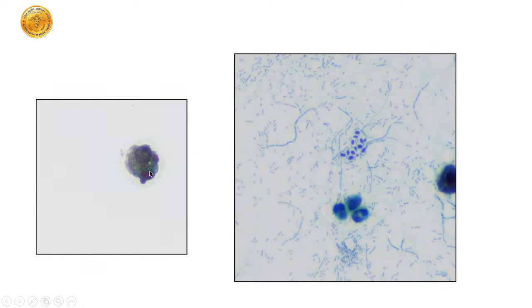So I'm sure everybody can make out, just look at these elongated bacteria, some polymorphs here. These are yeast forms of Candida. Anybody? What are these round red inclusions in this degenerated urothelial cell? You can type out your answer.